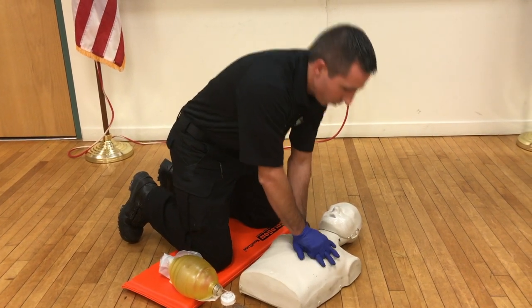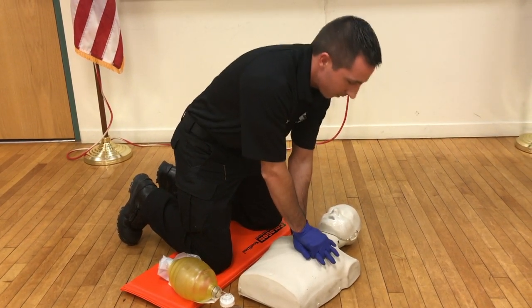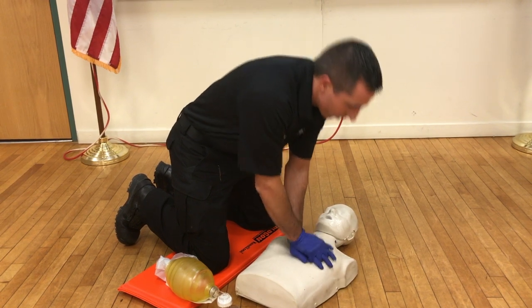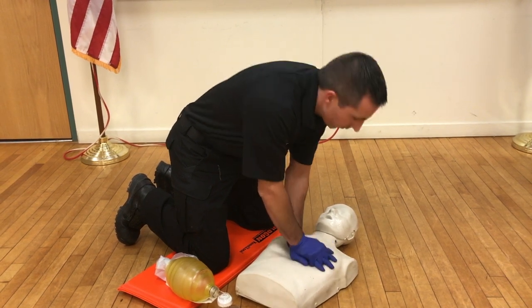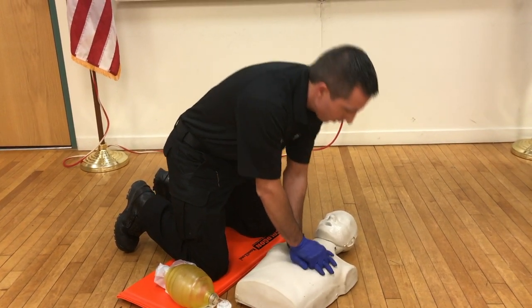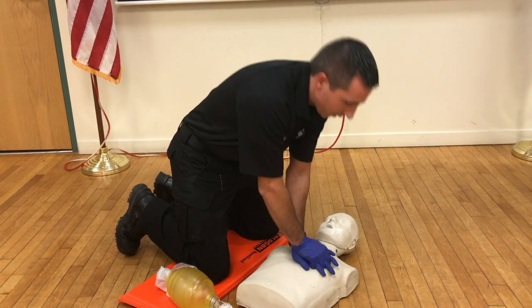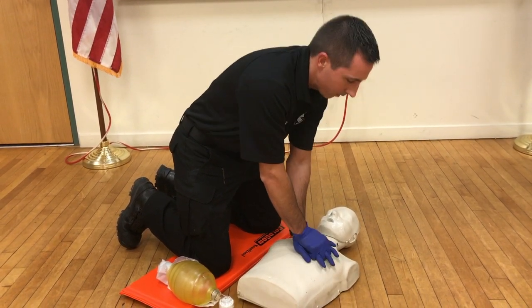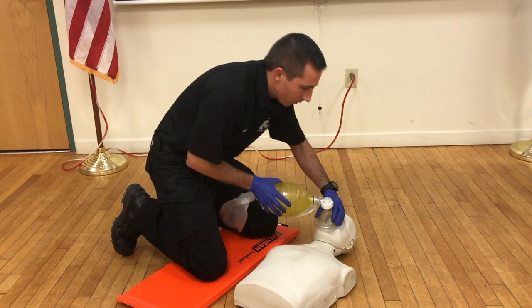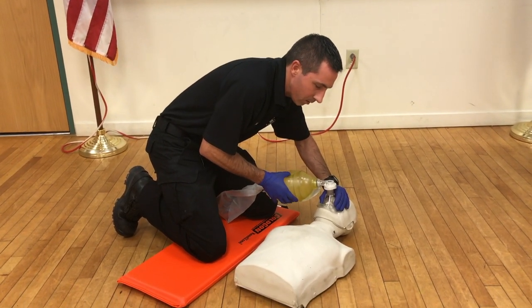Third cycle of compressions: 1, 2, 3, 4, 5, 6, 27, 28, 29, 30. We open the airway, give two breaths.